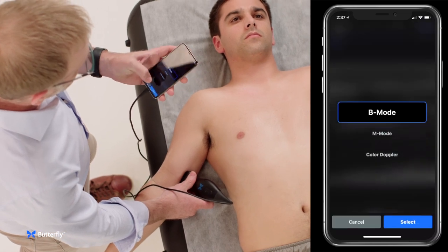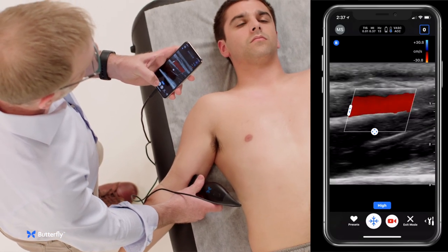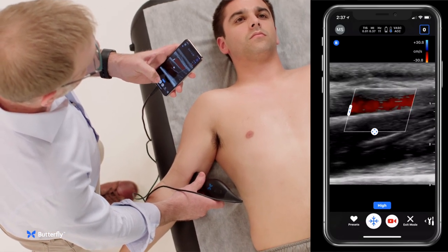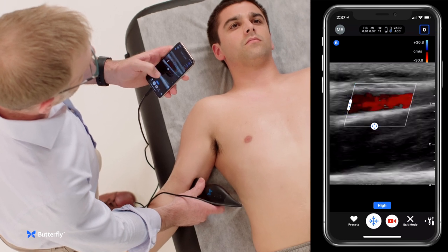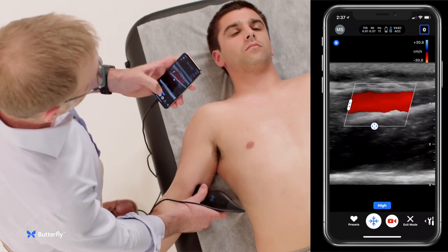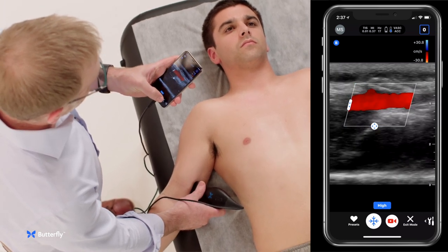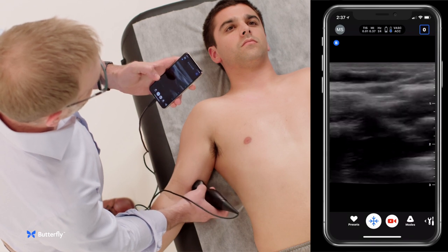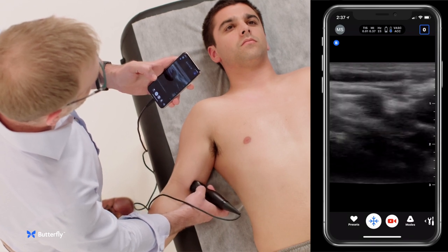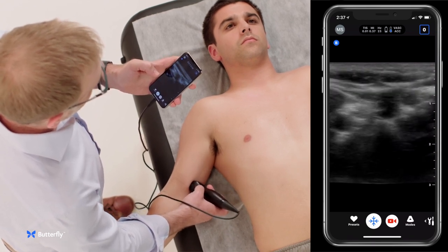If you wanted to use color to help confirm that you're looking at the vein, you could use color and make sure that you've got good flow within the vein, or you could just use B-mode features like compressibility to identify that you're looking at the vein.